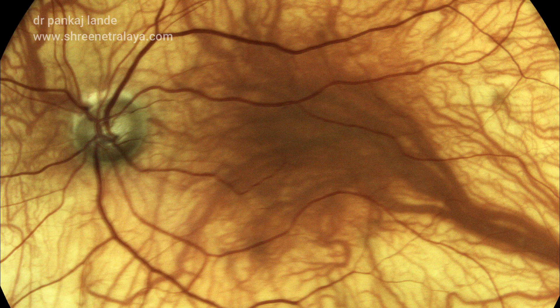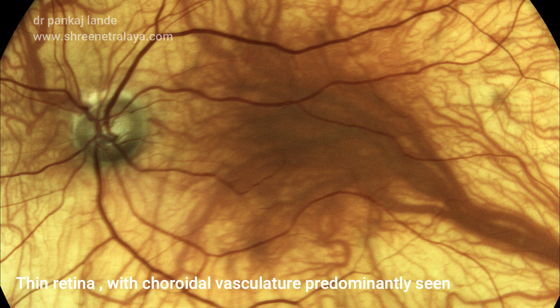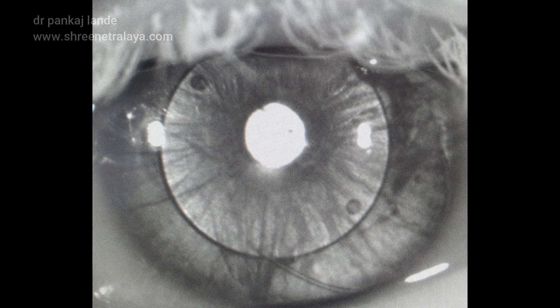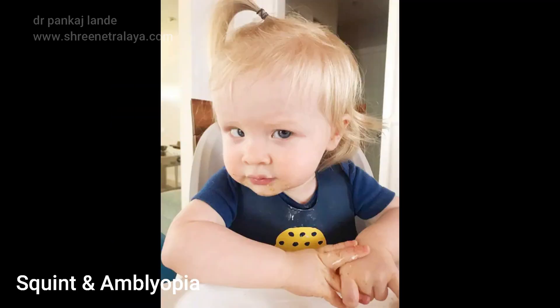The retina is very thin and choroidal vasculature can be seen predominantly. These are retro-illumination images of the same patient showing iris vasculature and IOL. A few cases may have squint with associated amblyopia.